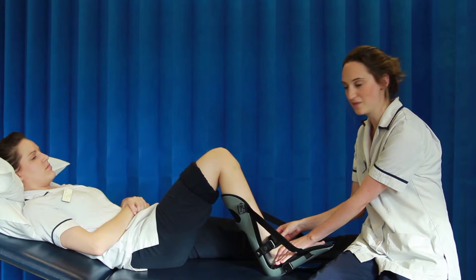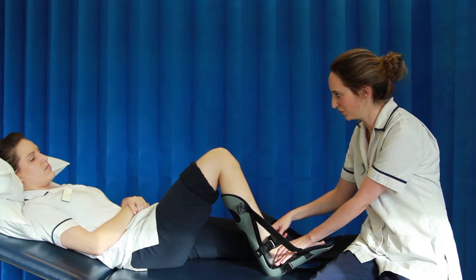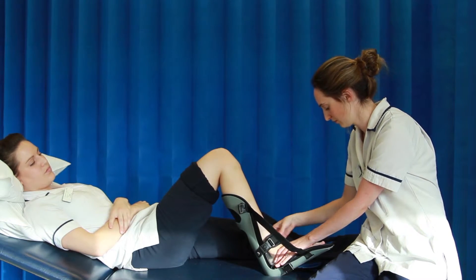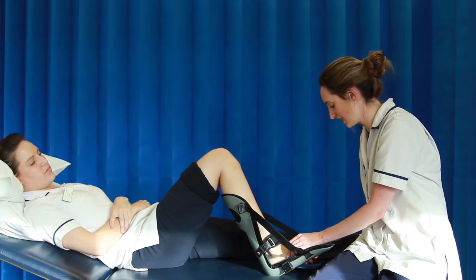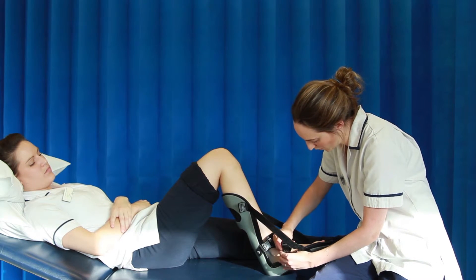There is velcro over the top of each strap. This will allow you to tighten the straps if needed to hold the foot even more securely. There is a second strap further down to also hold the foot in place, and this can be secured in the same way.